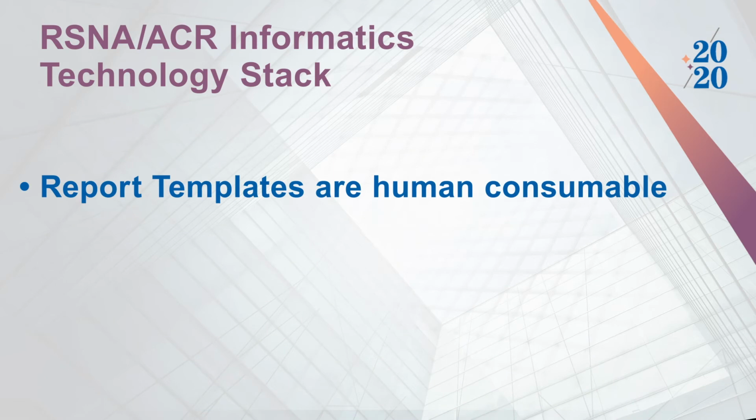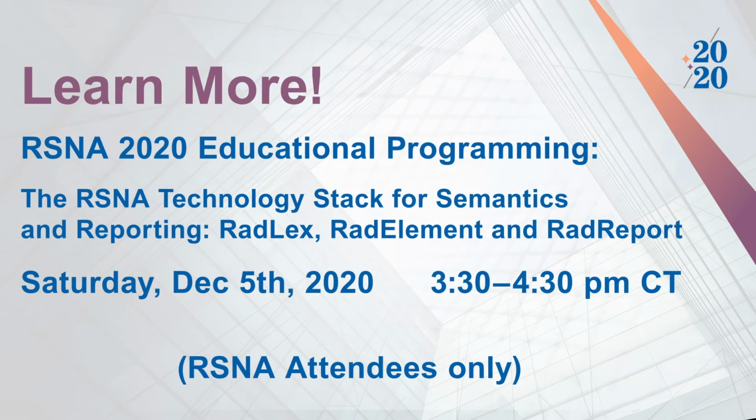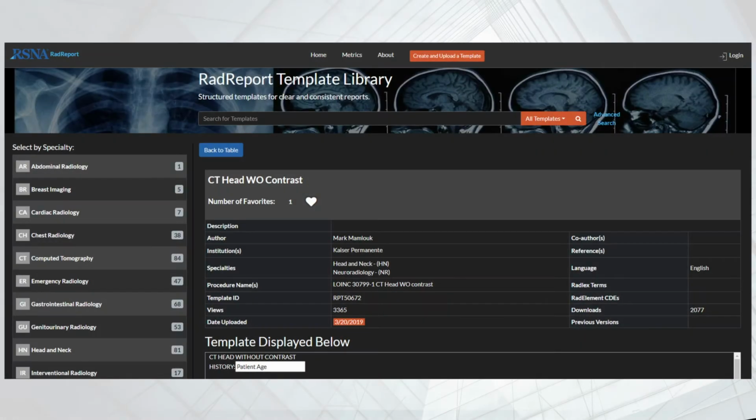While the report templates are aimed at a person reading the text, the CDEs and RADLEX codes are aimed at being computer readable and providing clarity when transmitting data between clinical systems and even translating text into other languages. Let's see how AI can help implement the reporting stack and streamline the reporting workflow.